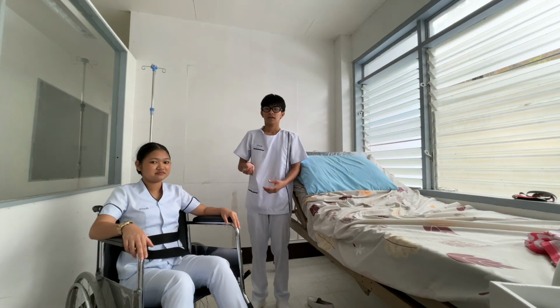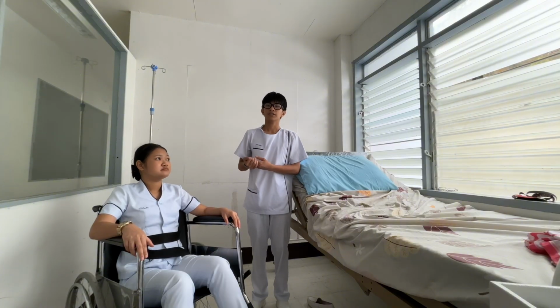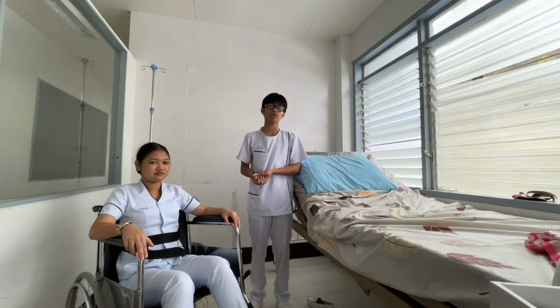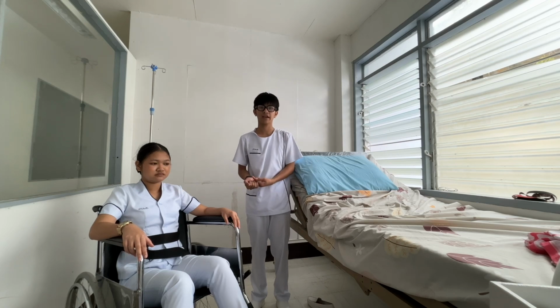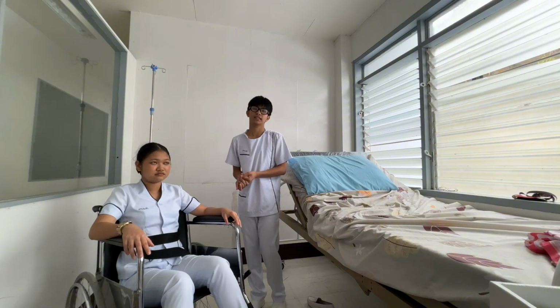Next is, as the patient sits down, shift your weight from back to front with bent knees, with trunk straight and elbows slightly bent. Ask the patient to use her arms to steady herself on the wheelchair and allow the patient to sit in the wheelchair slowly using an armrest for support. Flex your knees and lower the client onto the wheelchair.